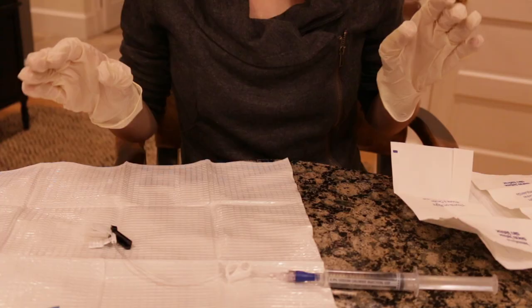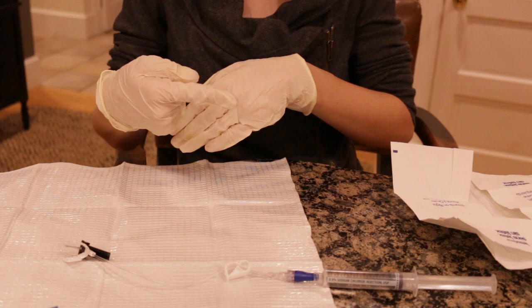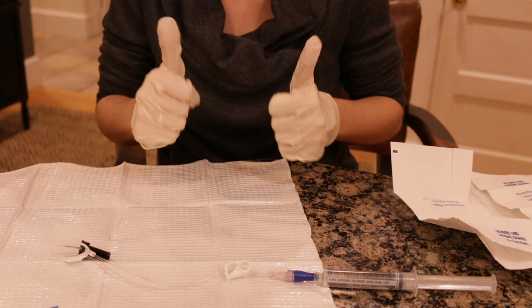All right, I'm fully sterile now. From here on out you can touch from here over because this is still sterile, but remember don't touch that syringe because it is not sterile. You can go ahead and watch the rest of the procedure as we filmed it earlier, because I do have the salines in my dressing change kit. I hope this was helpful if you do not have those salines in your dressing change kit. Good job guys, you can do it.